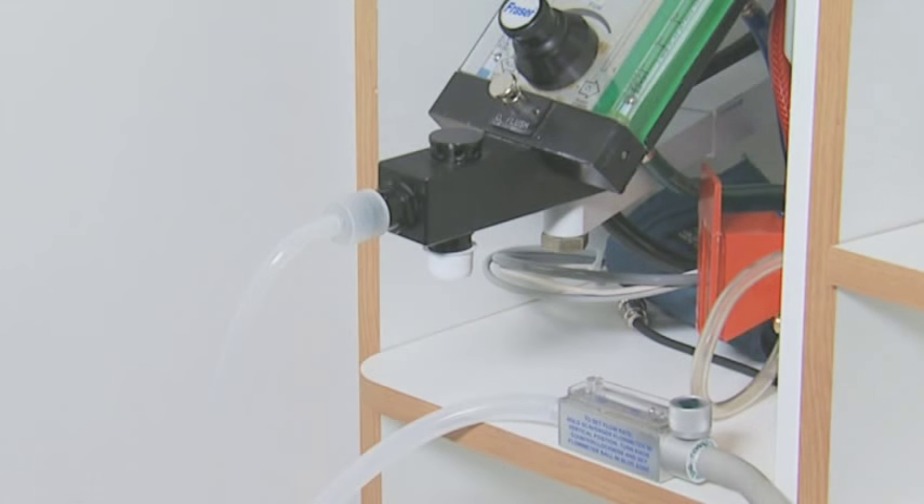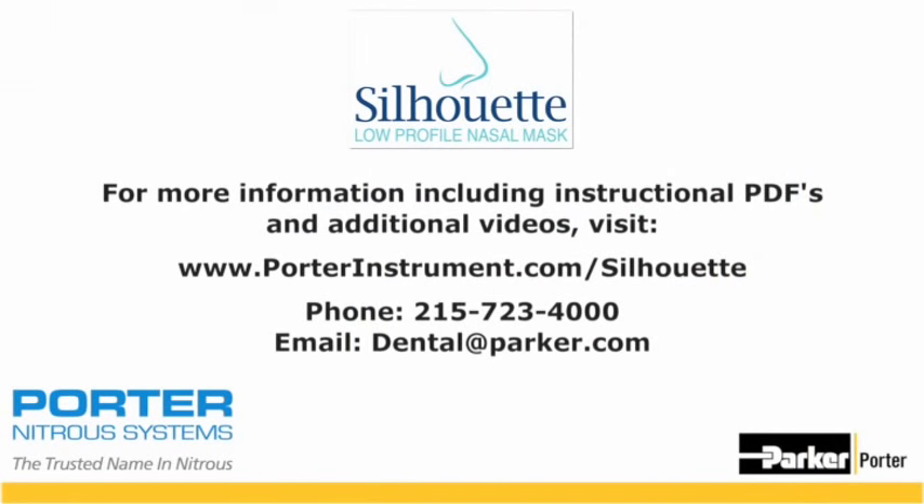The matrix system is now ready to use the disposable Silhouette breathing circuit.